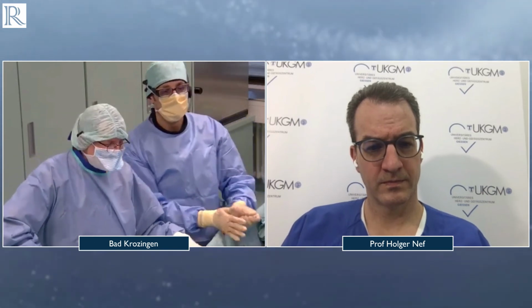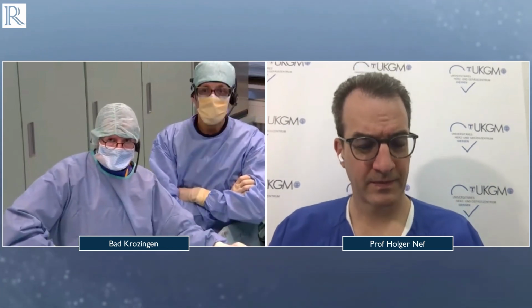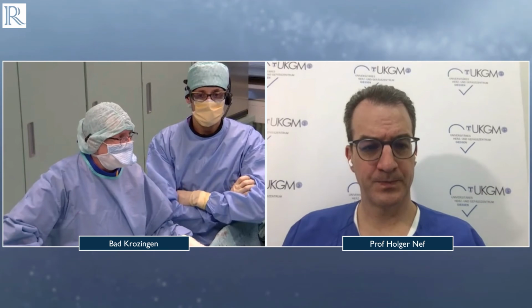If you have an option like we today, an eccentric lesion, but we discussed this case. Here in this case, we could, I think, not really win a lot with the rotablator. So we could maybe make some partial ablation of this eccentric plaque, but we will never be able to modify this calcified plaque in the way just shown by OCT.